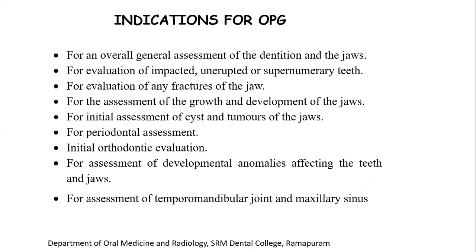So what are the indications for OPG? For an overall assessment of the dentition and the jaws, for evaluation of impacted, unerupted or supernumerary teeth, for evaluation of fractures of the jaw, for the assessment of growth and development of the jaws, for initial assessment of cysts and tumors of the jaws which are not easily seen in intraoral films, for periodontal assessment to evaluate the bone loss, for initial orthodontic evaluation, which is supplemented with a cephalogram, for assessment of developmental disturbances affecting the teeth and the jaws, and for assessment of the temporomandibular joint and maxillary sinus. When it comes to the TMJ, mainly the hard or osseous structures, the condyle and the articular eminence, are best visualized.